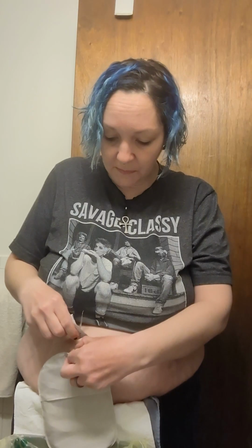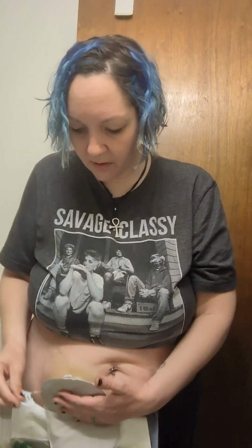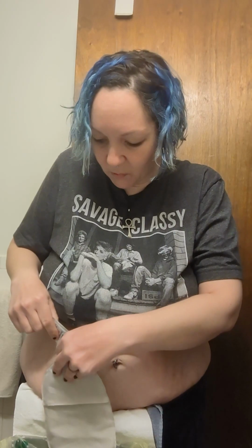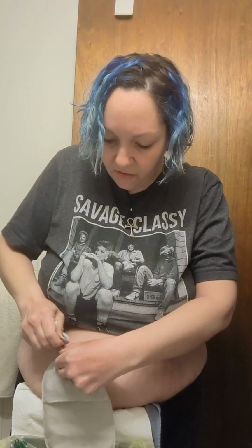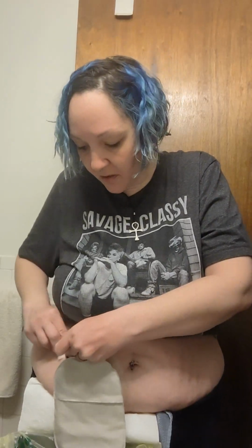Take the packet and turn it upside down. See how many packets it's going to take me? I hope you guys have patience. I brought the Golden Girls with me, I was wearing it today and I figured, you know what, why not? So yeah, I literally am just melting the adhesive off with this and using all the liquid inside of it because the wipes aren't that great. They don't help you with as much freedom. I try to save the spray stuff for emergency times or times I'm feeling stressed out. If you notice, I have a weird looking one of these on. I'll explain the different barrier strips later.